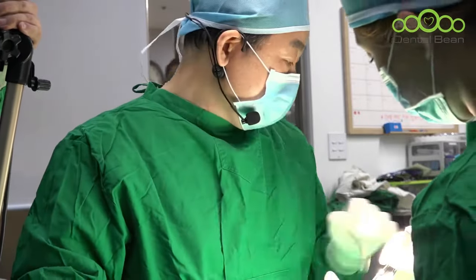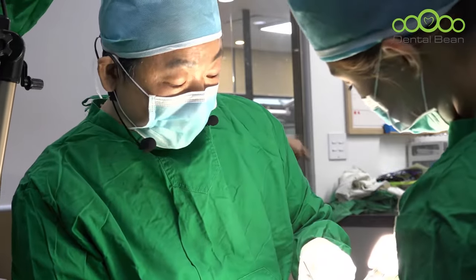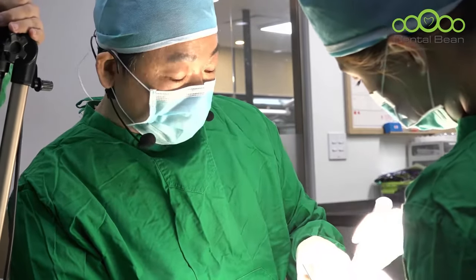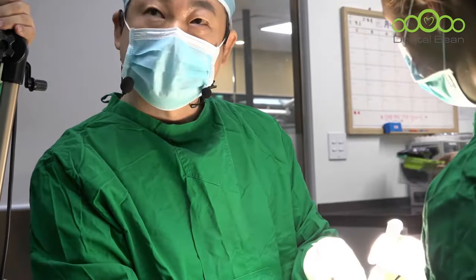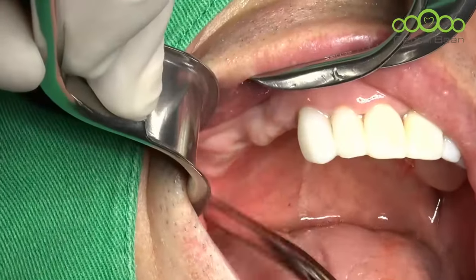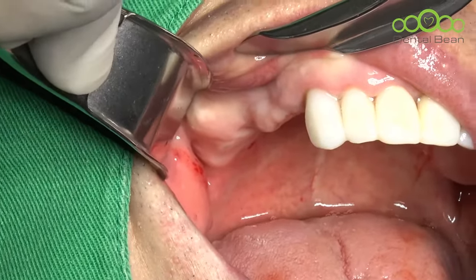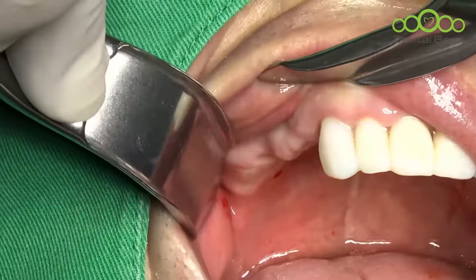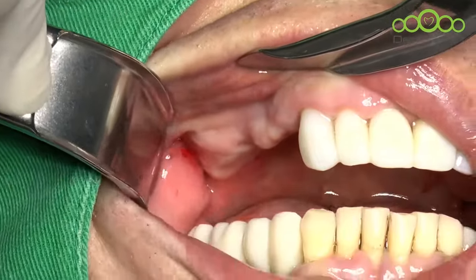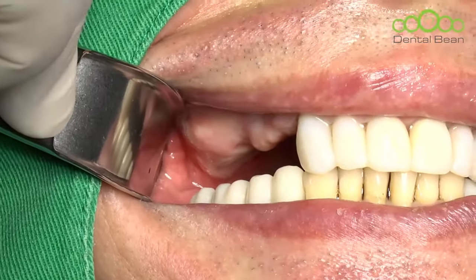I'll start the incision. Usually, I like to use number 12 surgical blade for crestal incision. Turn left side. How about? Good. Let's go. Close your mouth, please. I'm checking. Good. Open, please.